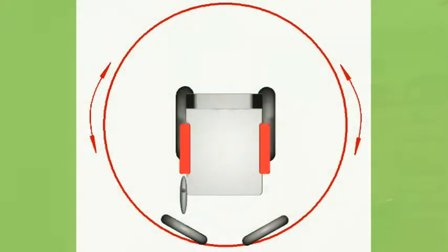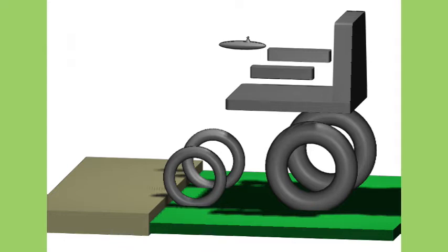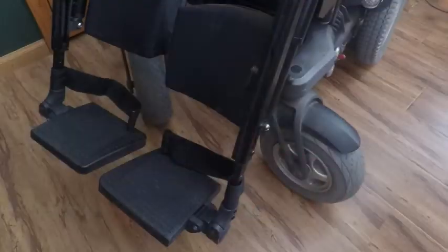The rear wheel drive configuration is also good for outdoors. Similar to the front drive configuration, the rear drive has only 4 points contacting the ground, and the drive wheels will always stay connected to the ground. My recommendation, if you choose a rear wheel drive configuration, is to select a unit with the largest front casters possible. The larger the casters, the easier it will be for the powered chair to climb over objects often found in uneven sidewalks or lawn surfaces. One disadvantage of the rear wheel drive is that the front mounted foot and leg rests must be positioned further forward to allow for the caster wheels to spin about freely, and that might enlarge your turning radius slightly.